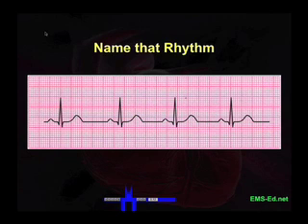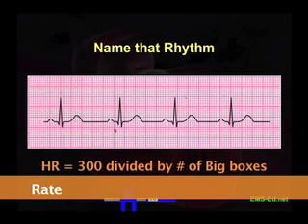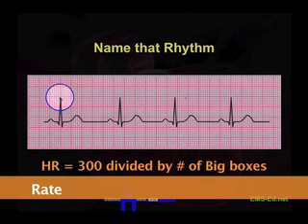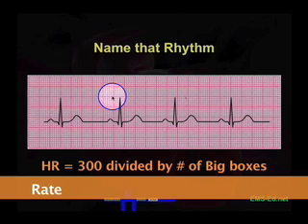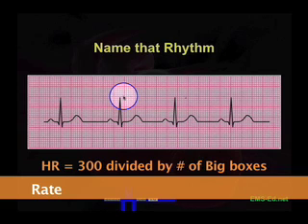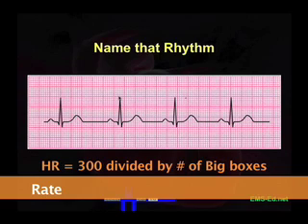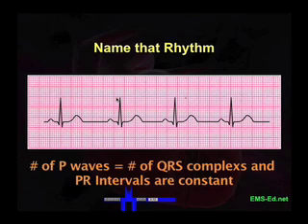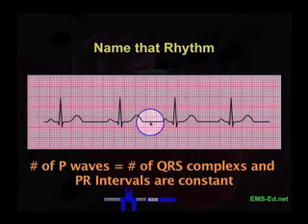Let's figure the rate. We'll find an R wave that's close to a dark line. Counting the big boxes: one, two, three, four, five — so five into 300 is 60. This is slower than 60, which would be 50. So between 50 and 60, let's call it a heart rate of about 54. It's sinus because there are P waves driving the beat and the rate is less than 60. P wave, QRS, P wave, QRS — the P waves are clearly driving the QRS complex.